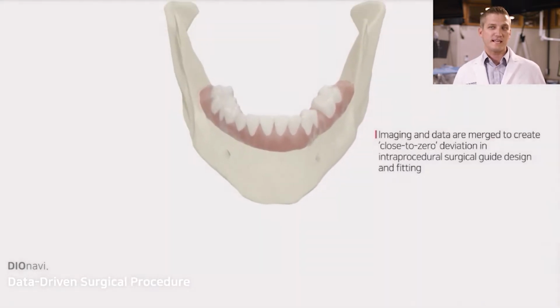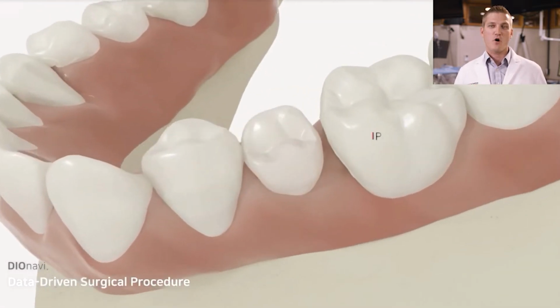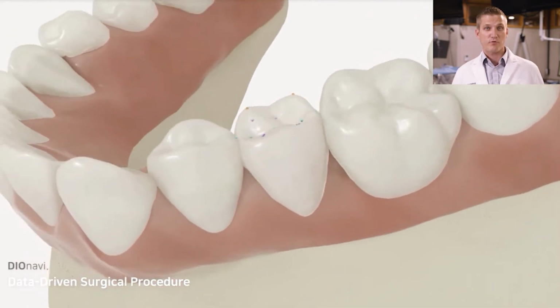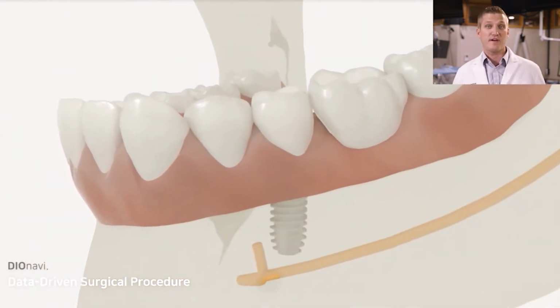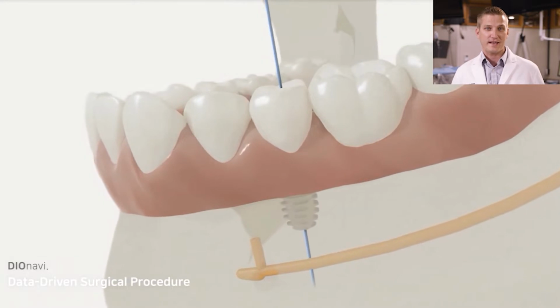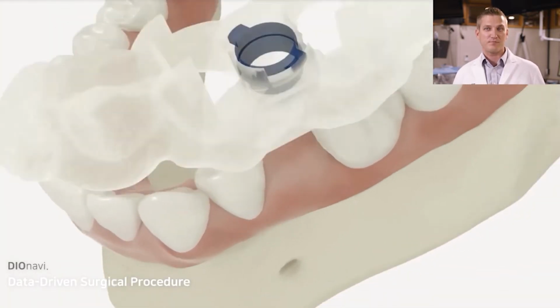So here you're seeing an edentulous spot in the mandible. We're always going to start with a prosthetic tooth first. So a tooth is going to be placed in the virtual world, and we're going to make sure it is in the ideal geometry to match the final restoration. From there, the implant is designed with respect to the anatomical structures around that area. And then, of course, complementing the prosthetic plan of the tooth.